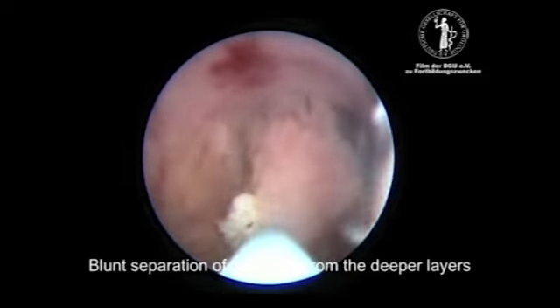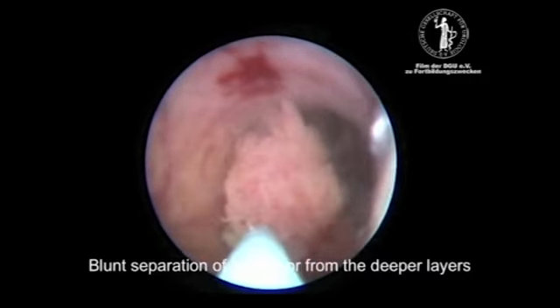The tumor is separated bluntly from the deeper layers with a ureter catheter.